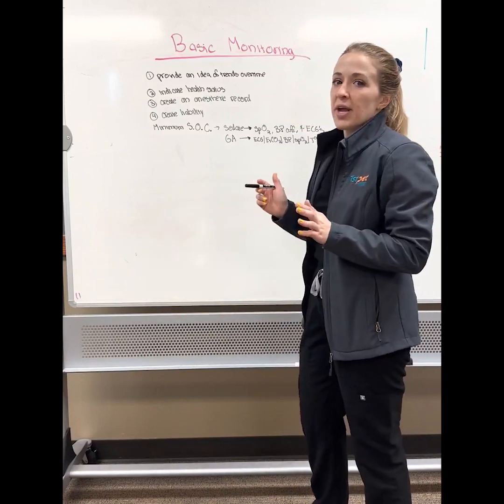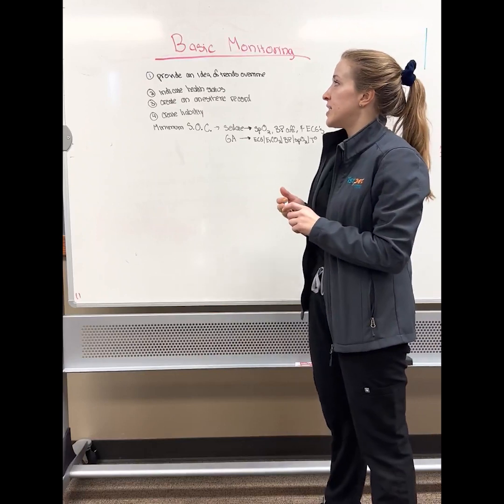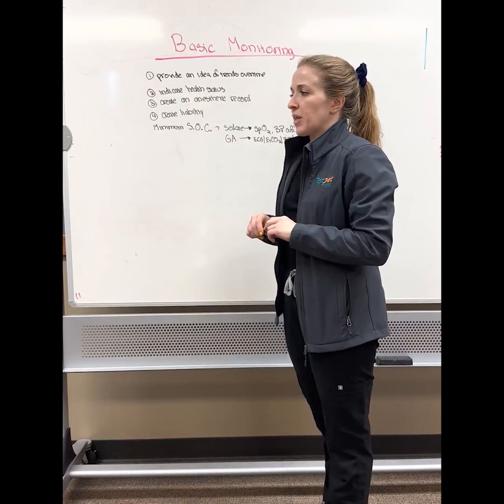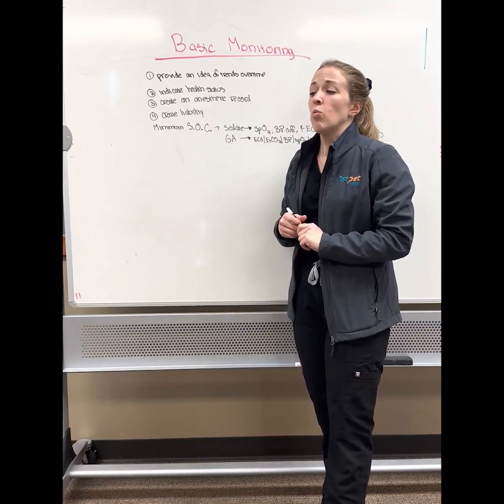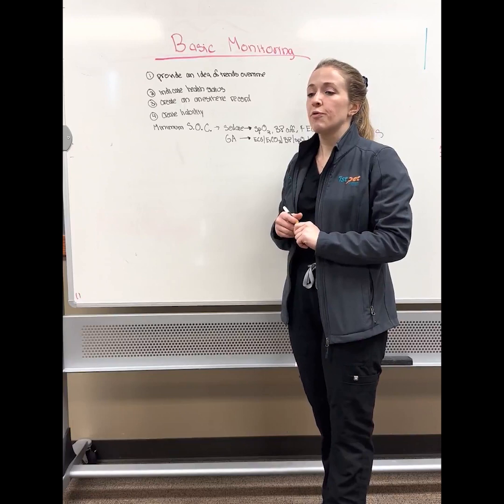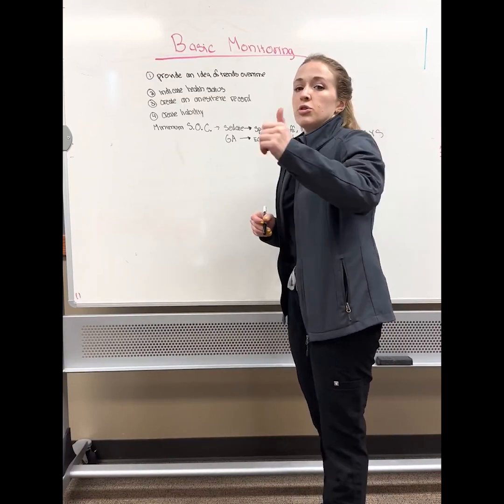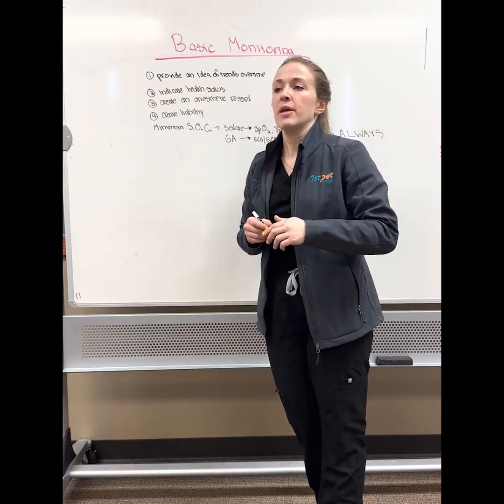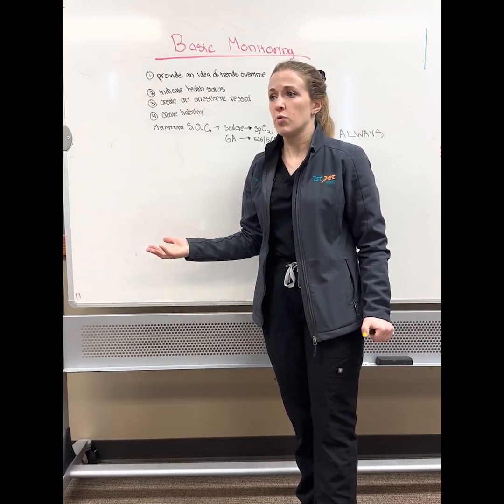So why do we monitor animals that are sedated or anesthetized? Number one, provide an idea of trends over time. Anesthesia and sedation monitoring is not just about looking at something that happens every 5 minutes. What you want to try to understand is that over the course of time, how is your patient responding to surgery? How is your patient responding to fluid therapy? How is your patient responding to your analgesic and pain relieving protocol?